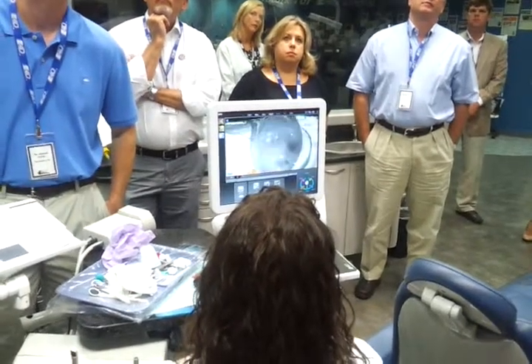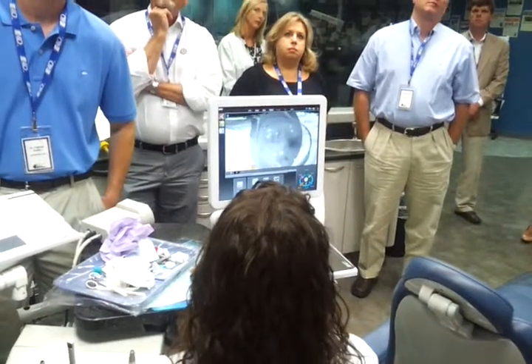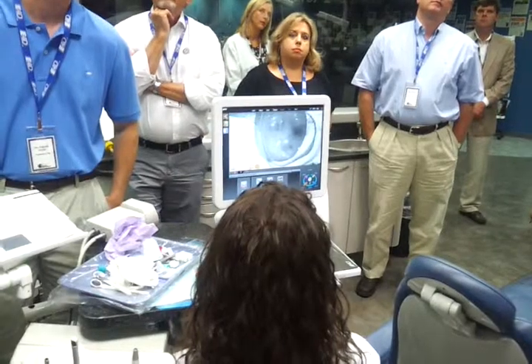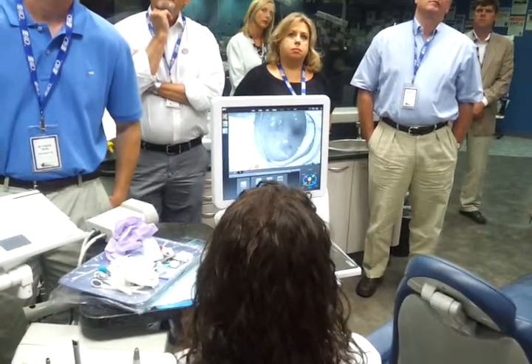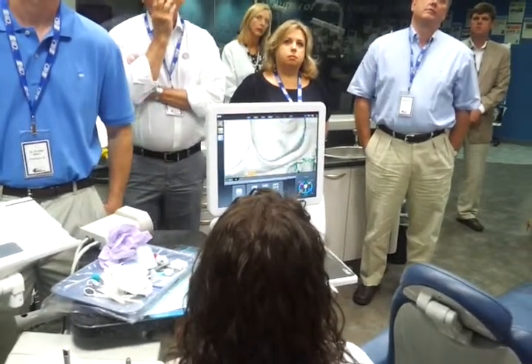But my deal is if I see it in stone, I set it in stone. But I can continue to adjust my margin, and because I know I'm not milling these out, I'm not going to spend a lot of time and make this perfect. But I can see that hard edge in this live view. This is called ICE Spotlight. So it puts a spotlight over the area that I'm trying to draw.